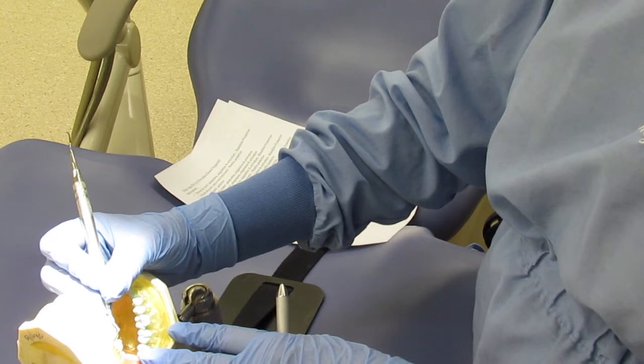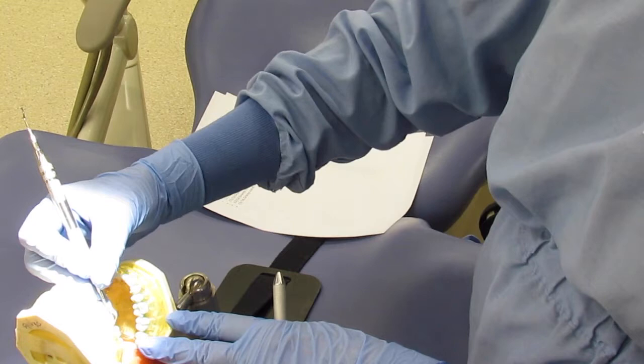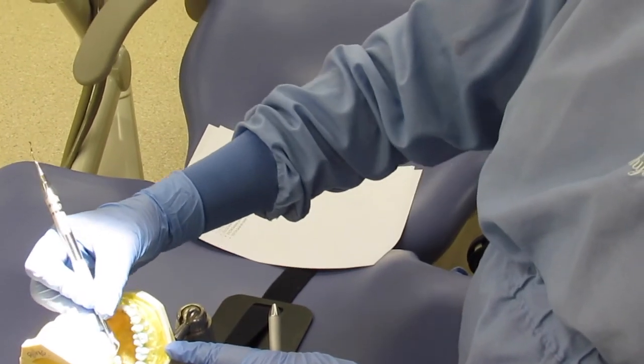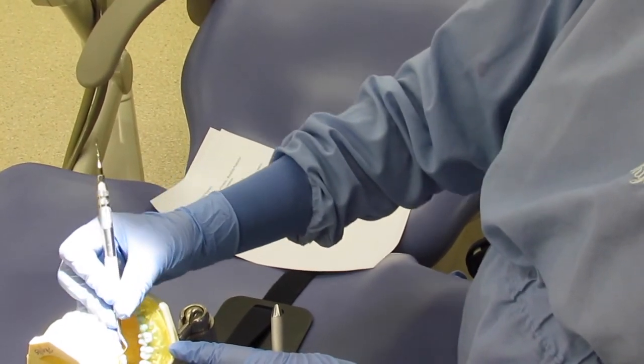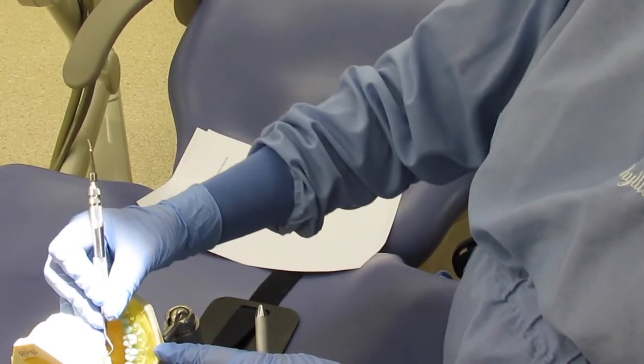Distal surface in number three, you're going to raise your handle slightly, use your secondary blade, and then little tiny up and down rocking strokes and pivot to come around into the interproximal col area of the distal.